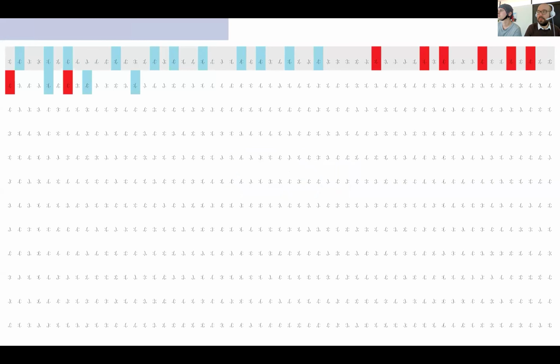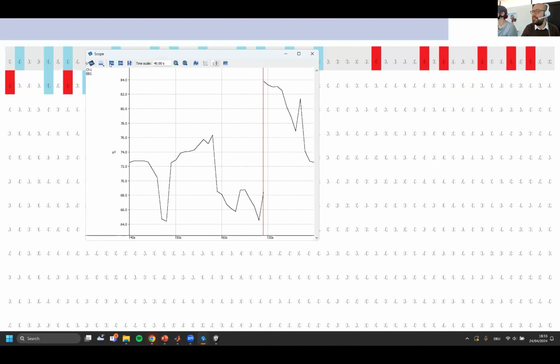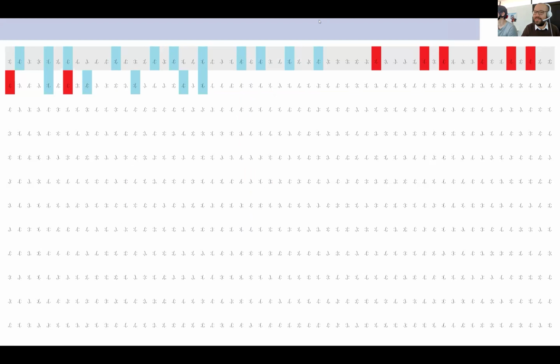I will ask MJ to give me the mouse so that the other ones can continue, and he can also continue to do the tasks. And then we can see here because the task was stopped, you can see the cognitive part just lowering. So it's hard because you need to have it activated for them to be concentrated.